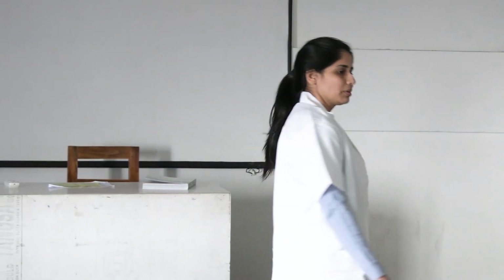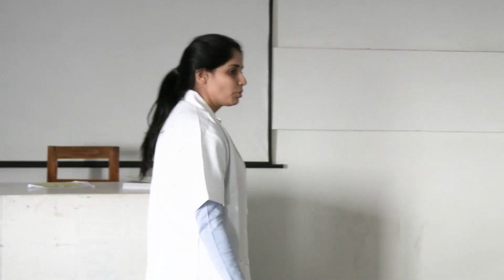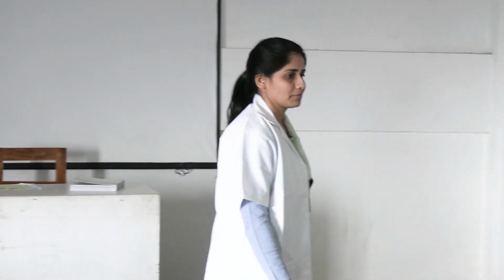Second is, have you heard about chlorhexidine? Okay, it's another thing that we are using, or povidone iodine. You might have heard of Betadine. Yes, it's a brand name for povidone iodine. So how long should you wait after applying chlorhexidine or povidone iodine? 1 minute minimum. Okay.